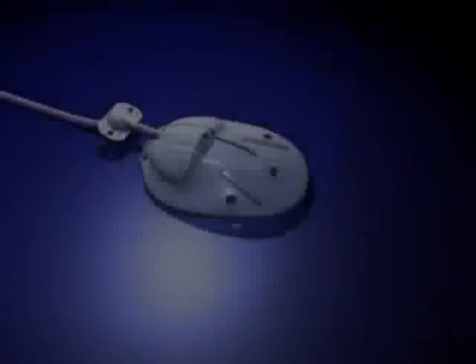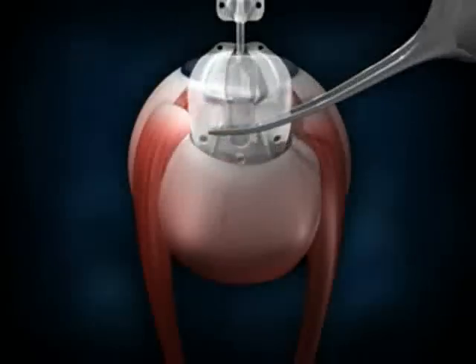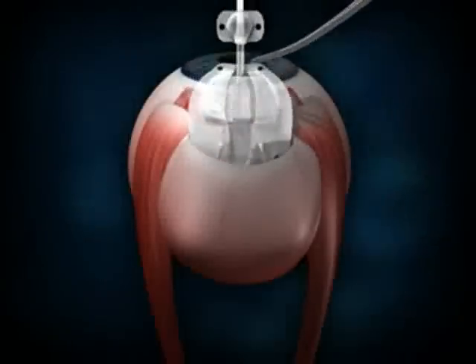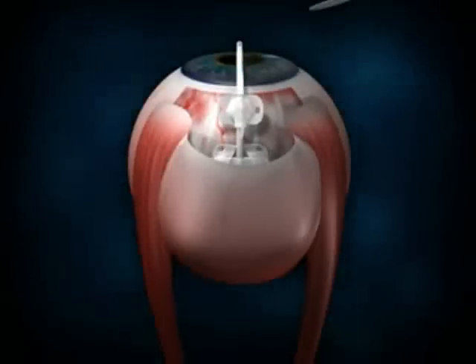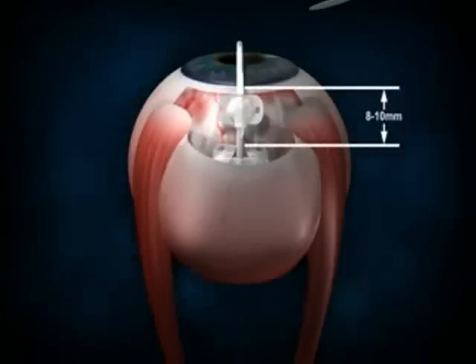Placement of the valve. It is important to avoid holding the valve at the center. Always begin by holding the valve at the edge and push it into the previously created cavity. The valve will slide in easily. Continue to push it in until it can distinctly be seen 8 to 10 millimeters away from the limbus.